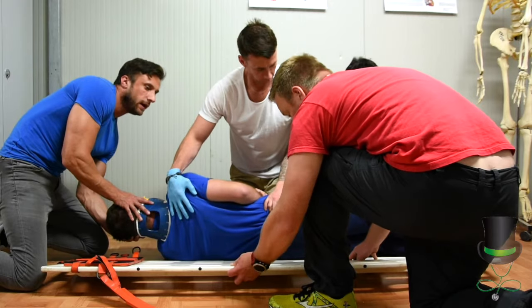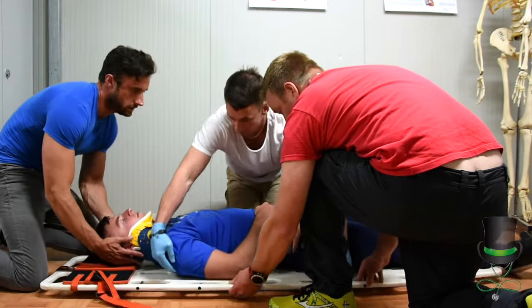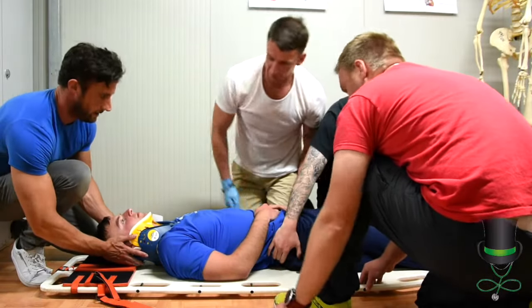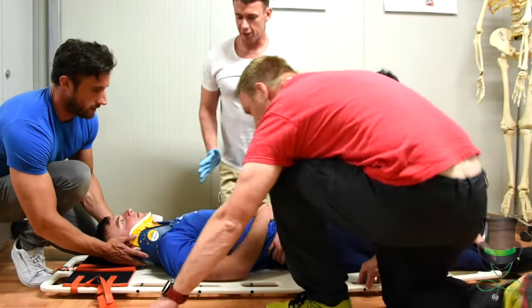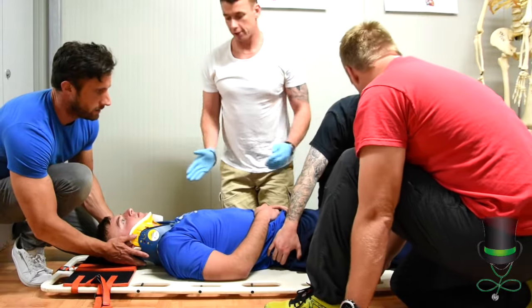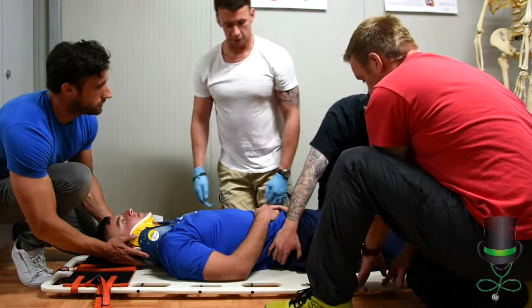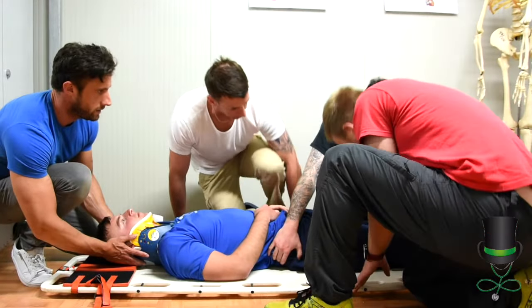Prepare to lower, and lower. Once the patient is on the spinal board, we don't slide the patient across the board — we must move him straight up or straight down. We have to centrally align the patient.